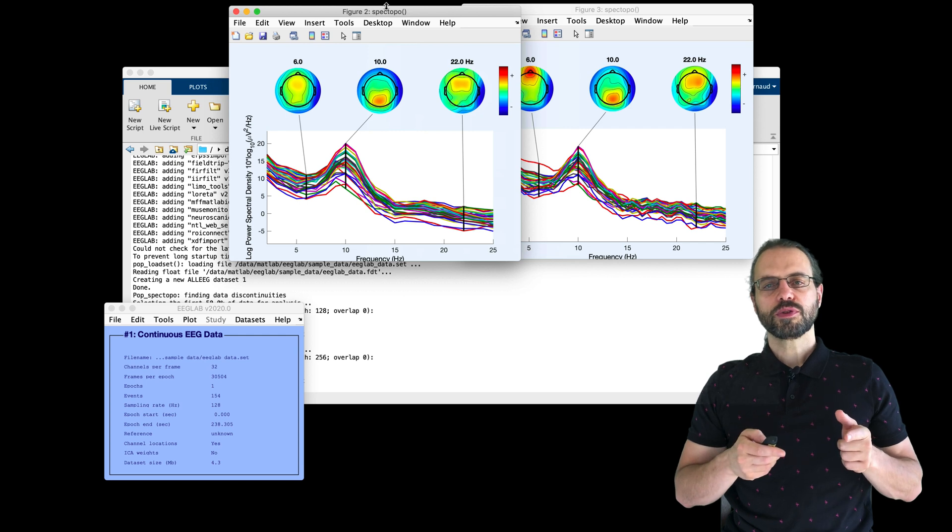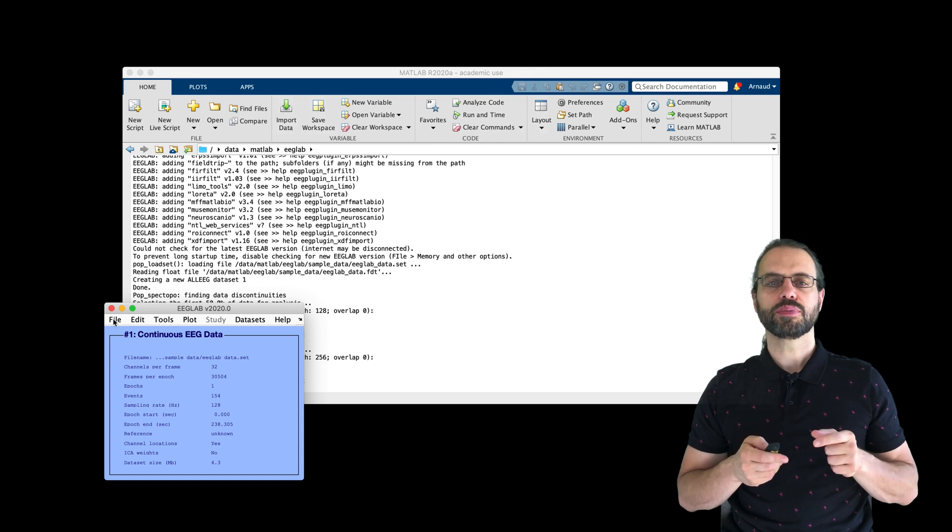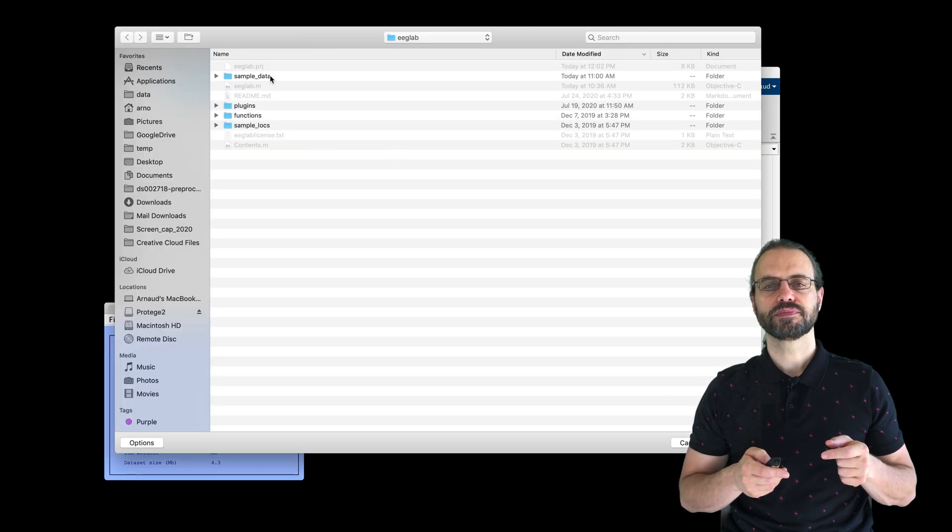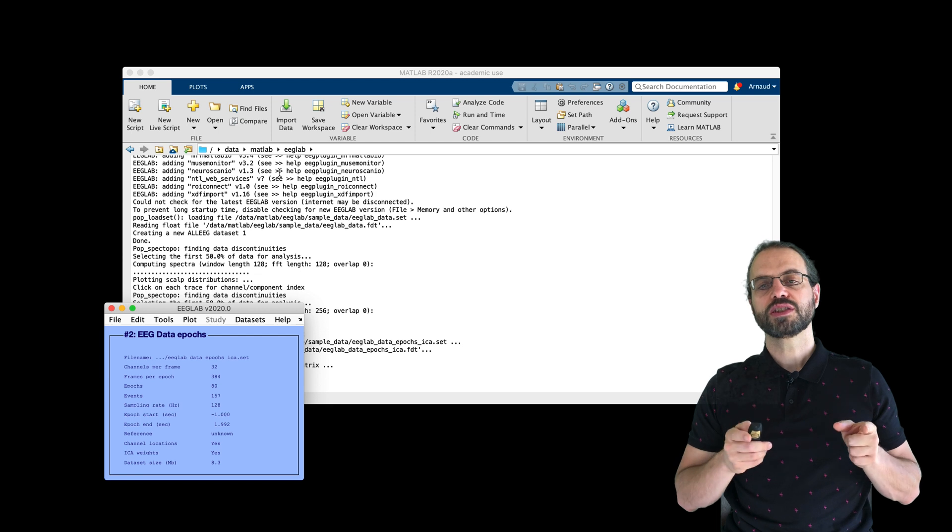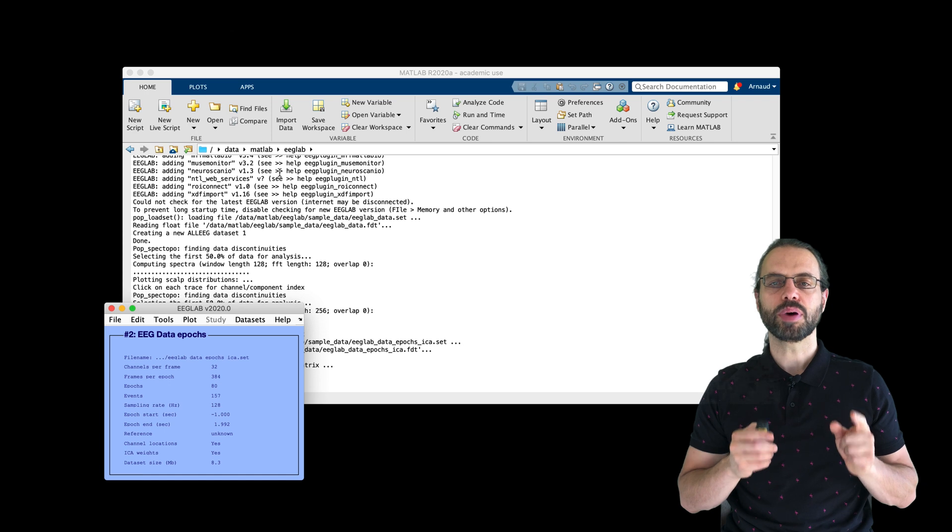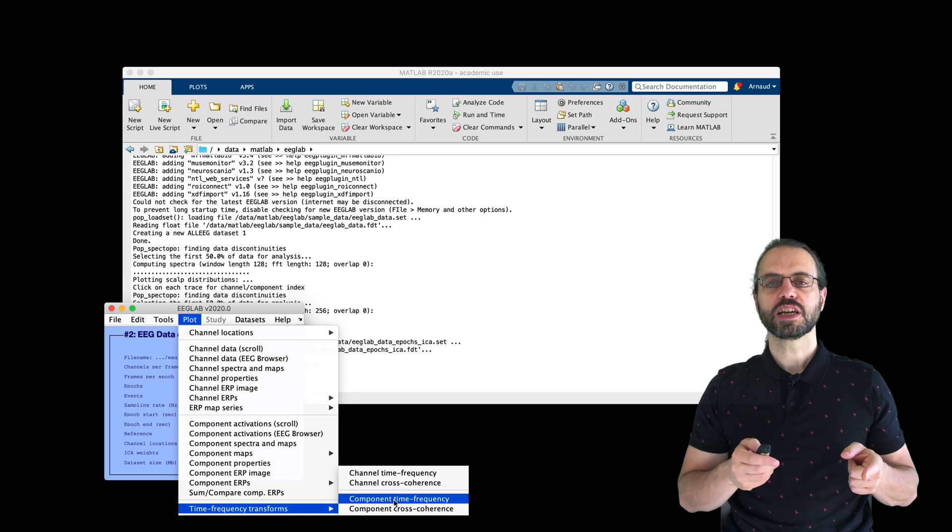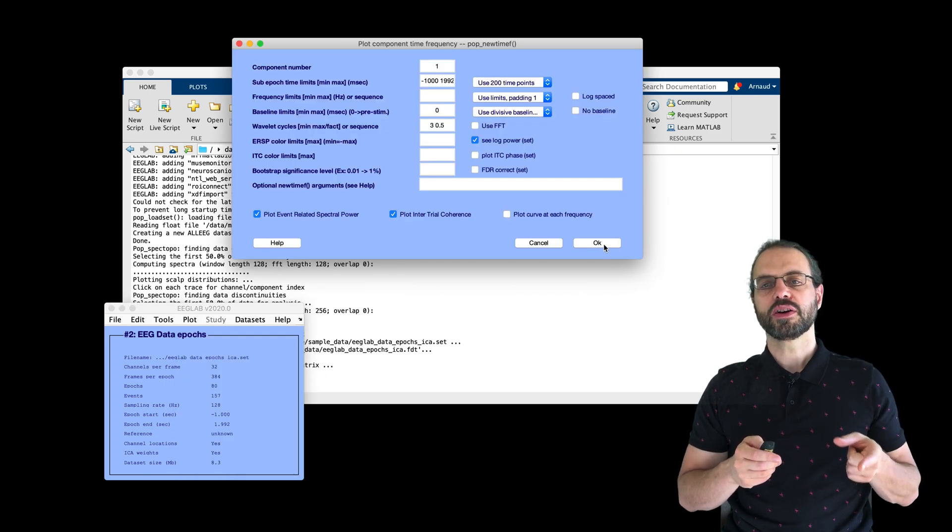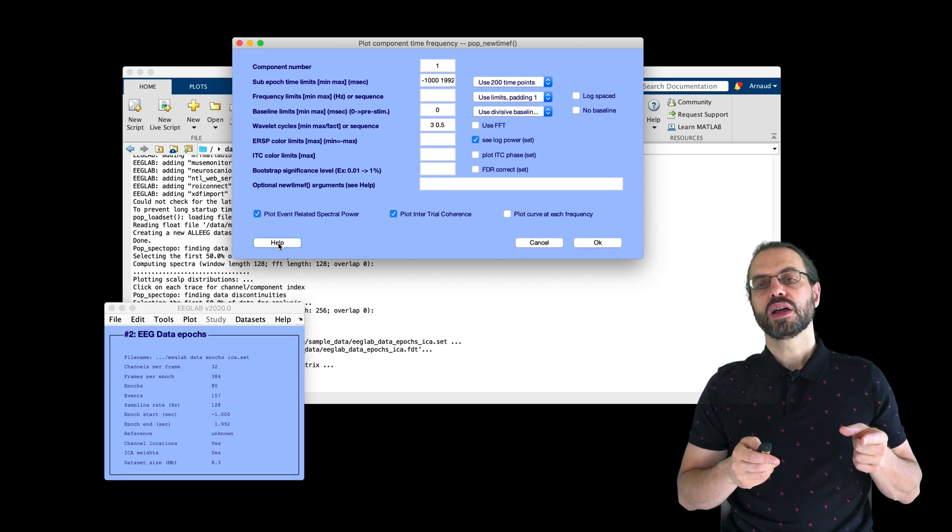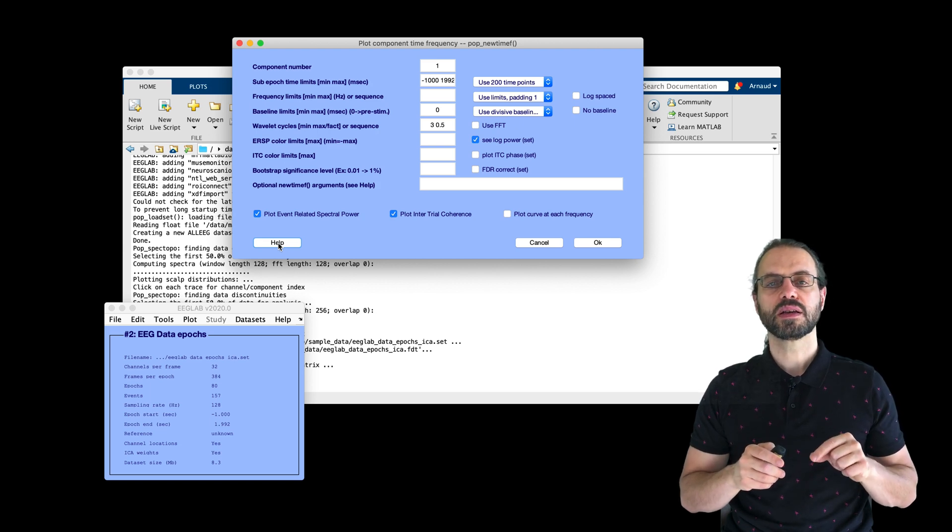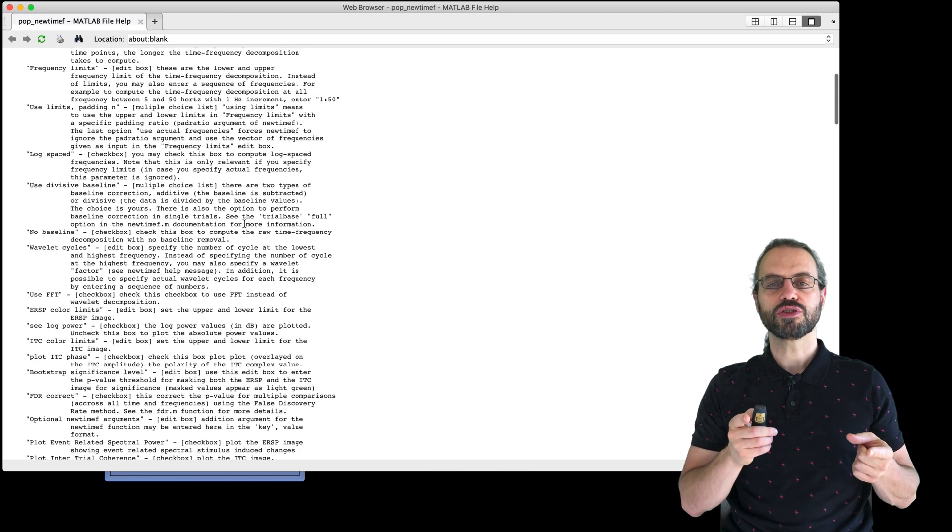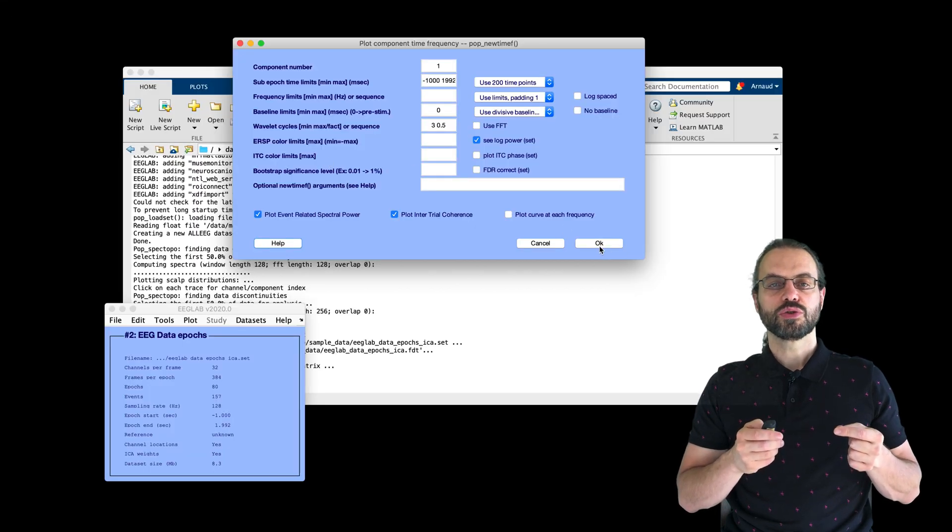So now let's move to time frequency decomposition. For this, I'm going to import the other example dataset which already has data epochs extracted. As a reminder, for both ERSP and ITCs, we need data epochs. Now I go to the menu to plot time frequency decompositions. I will plot the time frequency decomposition of component 1 and simply keep all the defaults. To get more help, you can press the Help button. And this provides information for each of the options of the graphic interface, as you can see here.